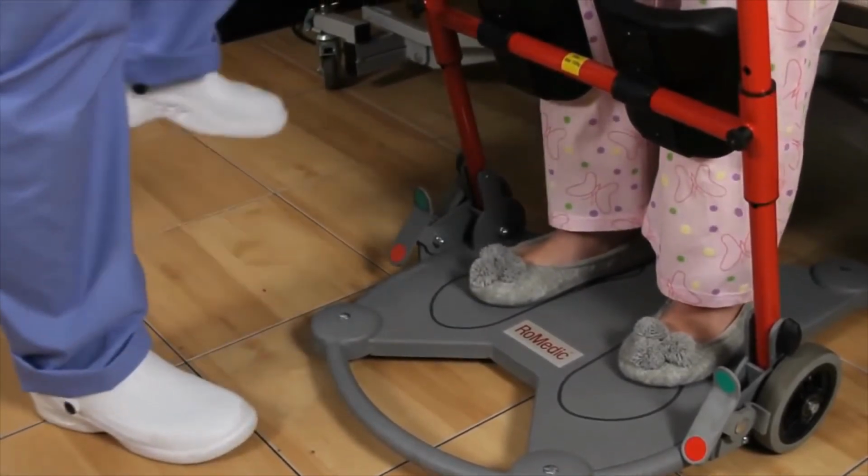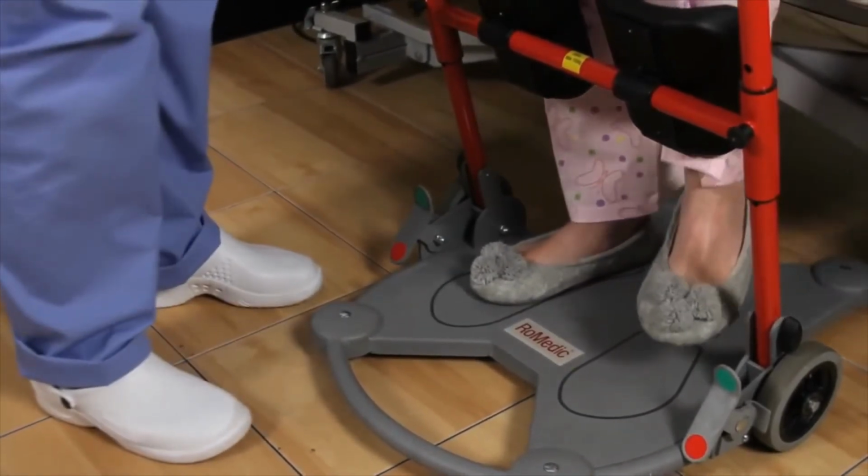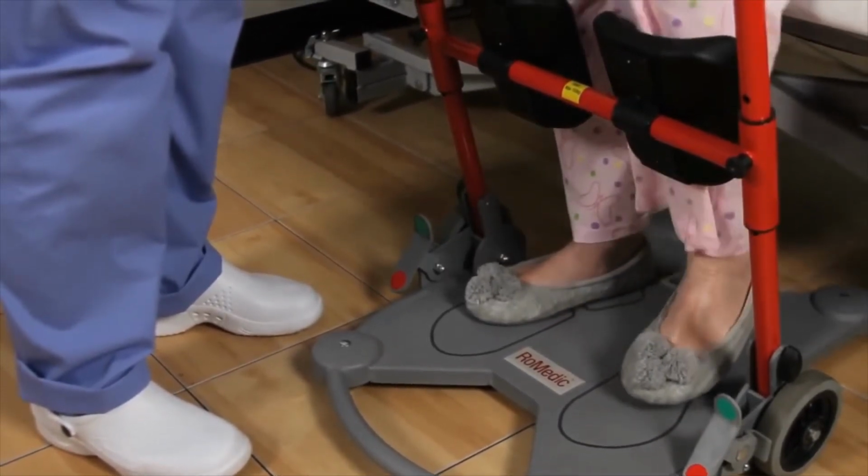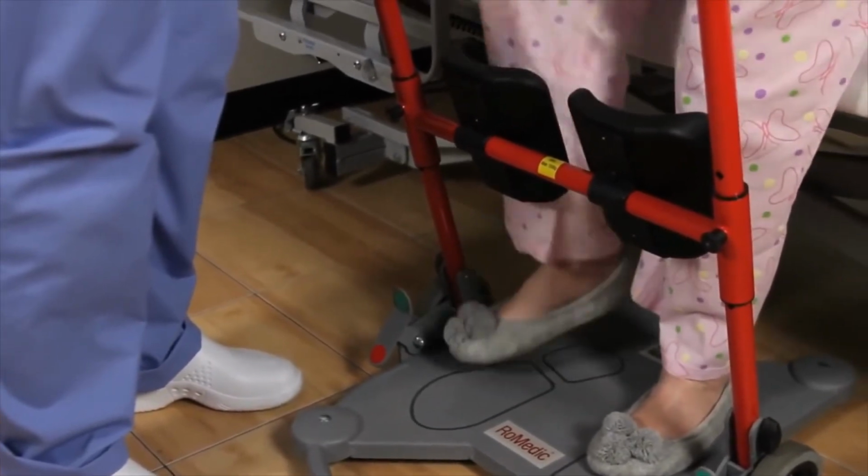In this test, we will assess the patient's ability to lift each foot. Ask the patient to lift their feet, left, right, left. If they can, then proceed to the time test.